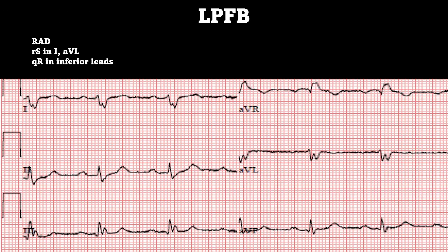Now for the left posterior fascicular block: do we see right axis deviation? Lead I is down and AVF is up — thumbs heading toward each other — so yes, right axis deviation. Do we see a small R and large S in lead I and AVL? Yes — a small positive blip followed by a dominant S wave. Do we have a small Q wave with a dominant R wave in the inferior leads? Yes. All three criteria confirmed — that's your left posterior fascicular block.